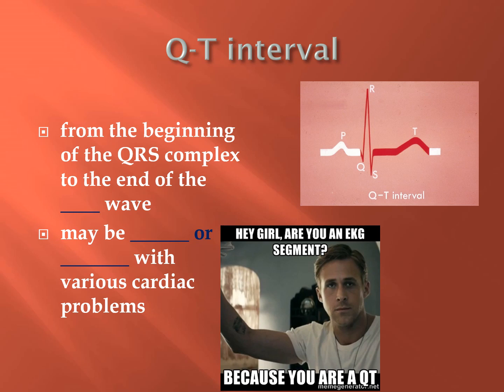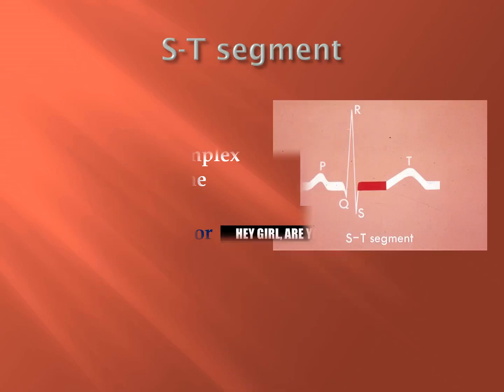If you have low potassium, or a severe electrolyte problem, this is where your QT interval can be affected. So we see these people with hypokalemia, hyponatremia, and so on. All these electrolyte imbalances, whether they're hyper or hypo, can cause either a shortened or prolonged QT interval. So if there's a QT interval that's abnormal, one of the things that should be evaluated is the electrolyte status.